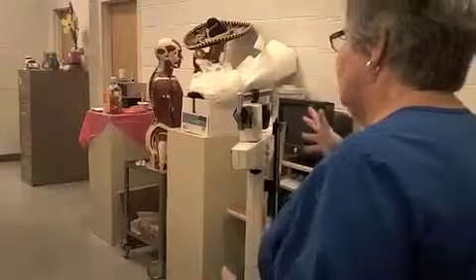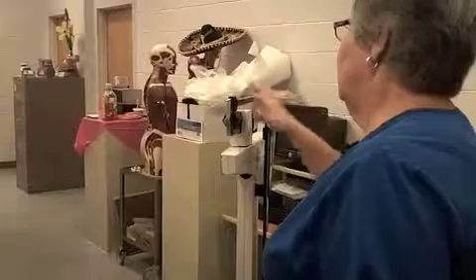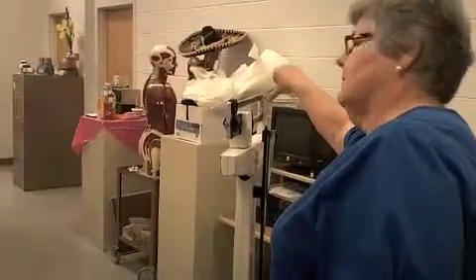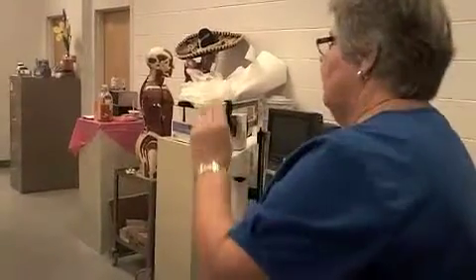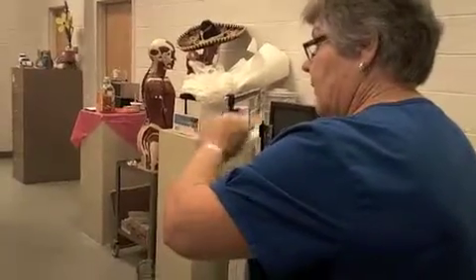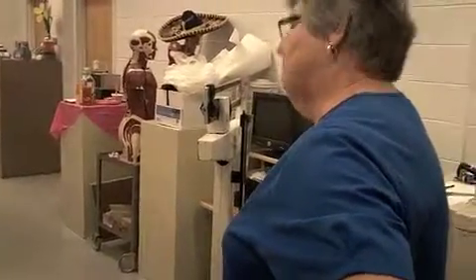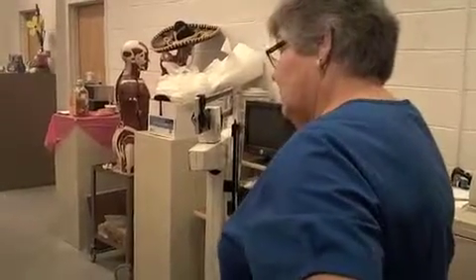But the kids get zeroing and balancing all mixed up. When they're doing this, they're zeroing out their scale to see if it is balanced, and it is. And if it wasn't balanced and it was on 0, 0 and you double checked it, that's when you as an instructor can come here and balance it with your dime right there. Mine's always stayed zeroed out, but I didn't know how to do that. Good question. I've had to change it. The shop teacher has used it and they drag it back and forth and then it'll come back and it'll be all out of kilter. And PE comes and gets them, that's what they used to do at my school.